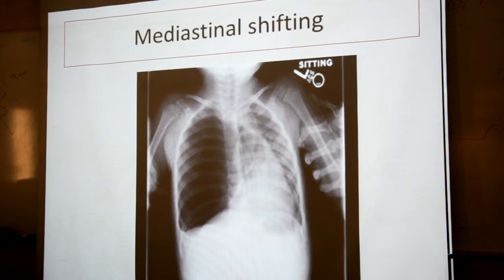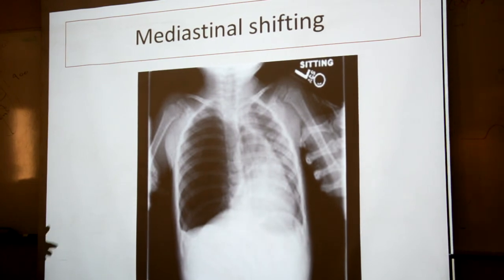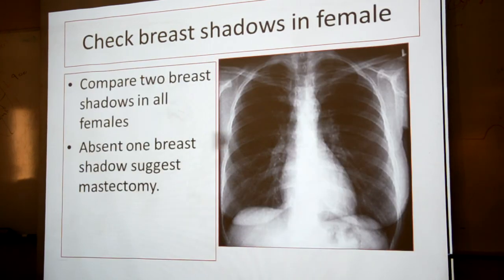Is it collapsed? The normal lung must contain vascularity. If it is collapsed, it should be white, but it's jet black. There's no vascularity. Emphysema? Emphysema should be a large lung with less vascularity. Could it not be a pneumothorax? Yes, pushing. The other lung should be collapsed.